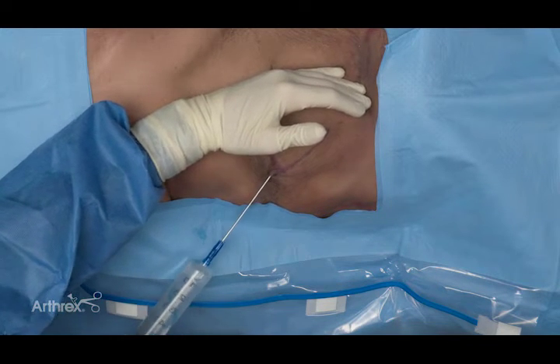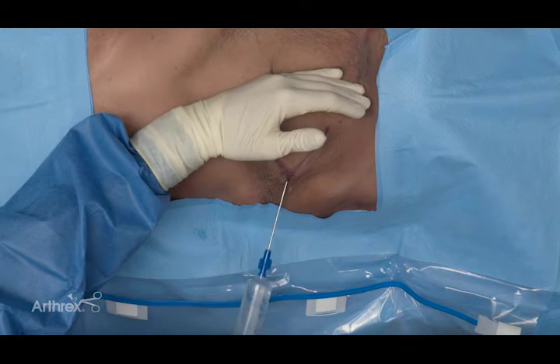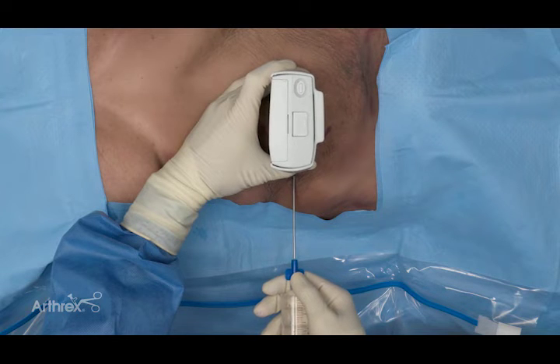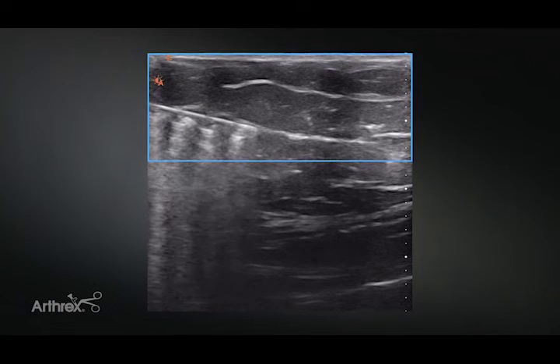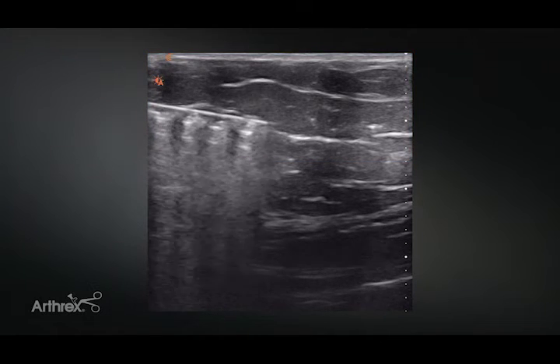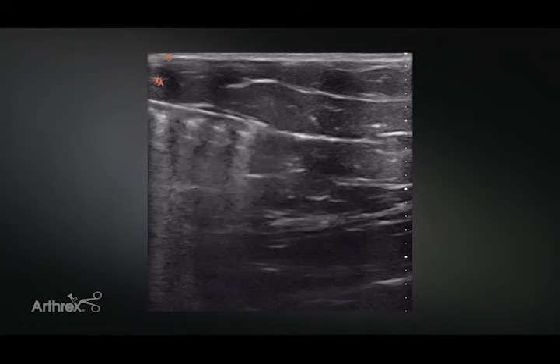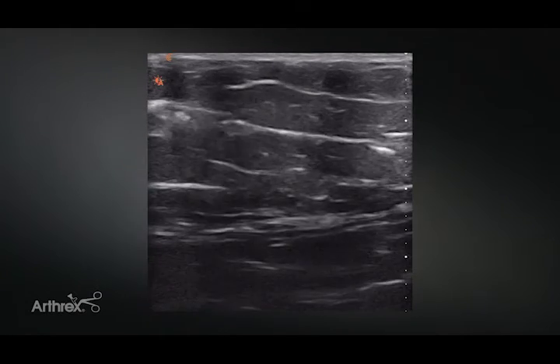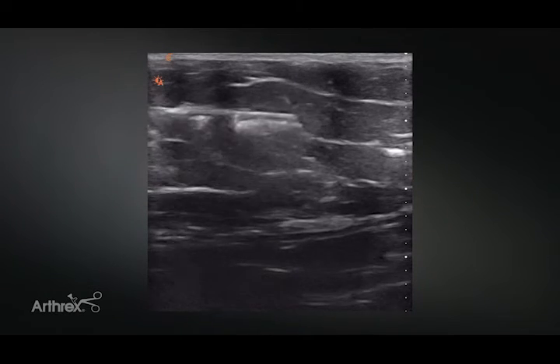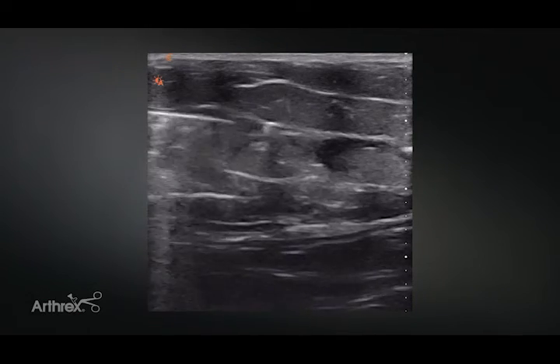The patient should be comfortable the whole time. If they're experiencing significant discomfort, stop, reassess, and you may need to administer more local anesthetic. Under ultrasound, you can see we're in the adipose layer, well above the abdominal musculature, with no excessively steep needle angle. As we move the cannula back and forth, you can see the needle tip moving easily through the adipose, and as we administer the tumescence, you can see those layers really start to expand — which is what aids with the harvest.